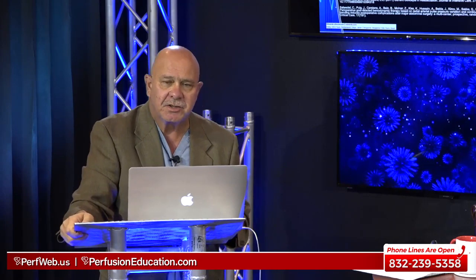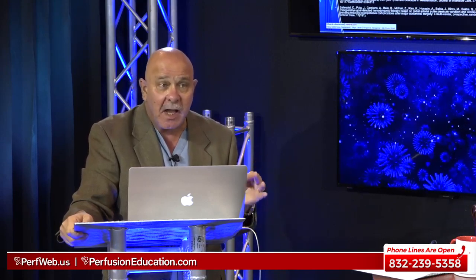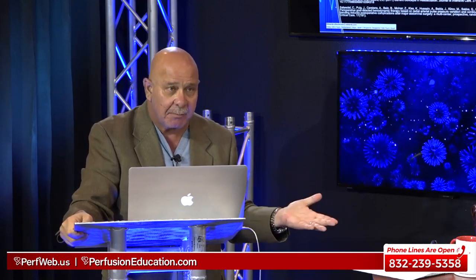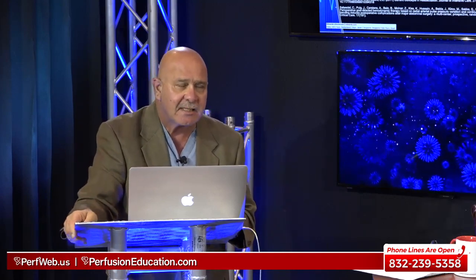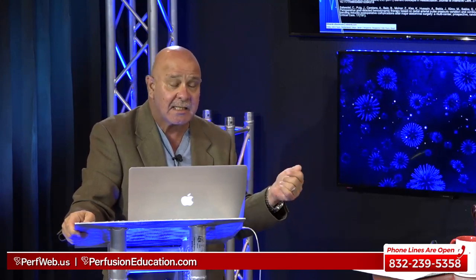That's a very, very good question. Again, it depends. If you're on veno-venous ECMO and you have a hyperdynamic cardiac output, let's say you can only get 5 liters through your ECMO, but the patient's cardiac output is 10 liters, and you have zero or limited lung capacity, then what you need to do in that circumstance is add an extra line. I have done VV ECMO with 2 accesses and 1 return. I have also done 1 access and 2 returns with success.